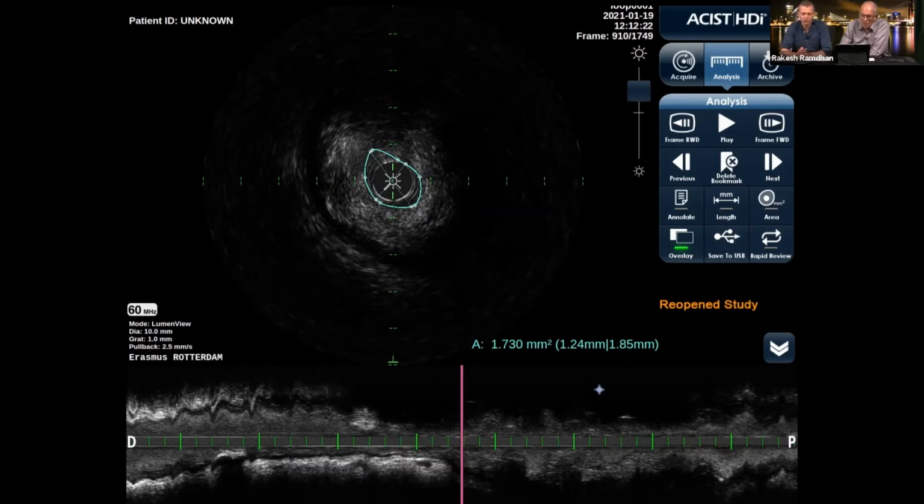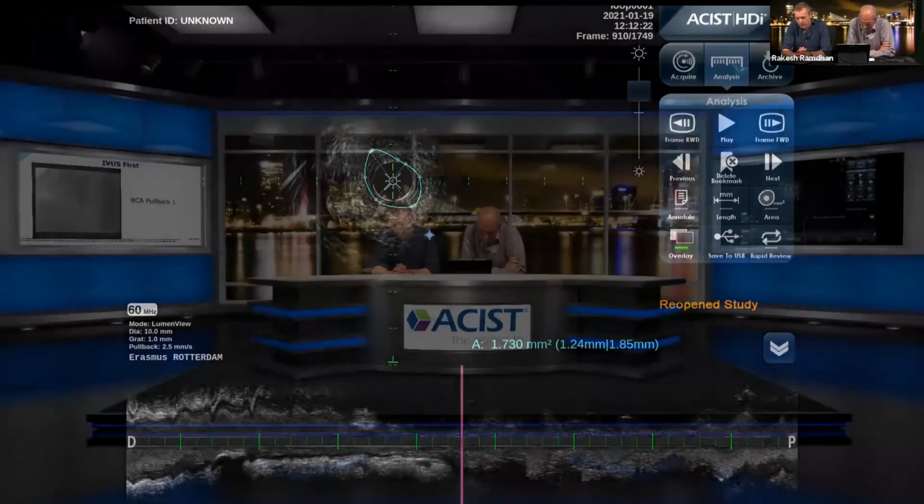This is something that is very easy to compute, and the newer versions of the system will integrate that in an AI approach to the lesion. What you said, the minimal luminal area is for stent sizing the least interesting. Absolutely. But don't bother any time for that. Jurgen, that's a very important comment, and I fully agree. The minimal luminal area per se has no meaning.